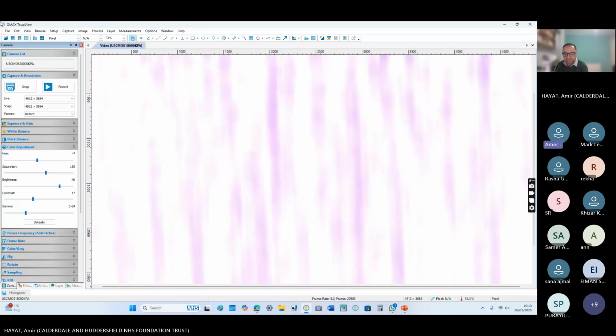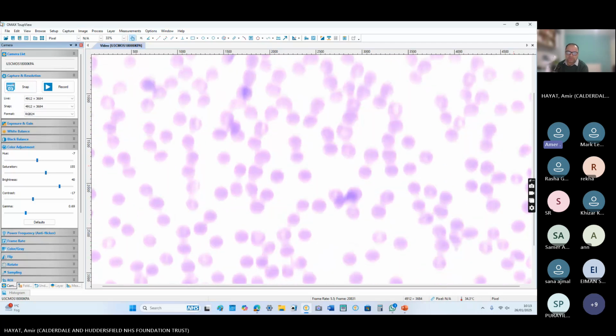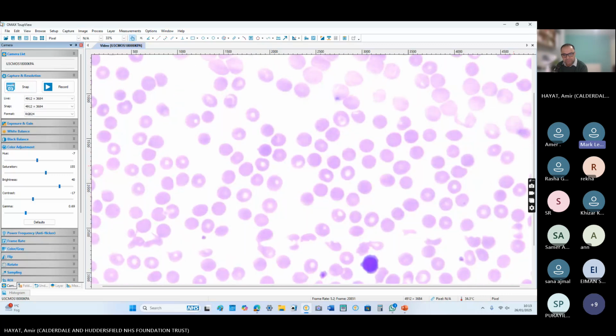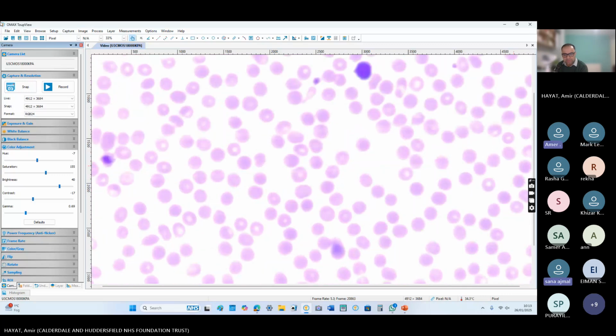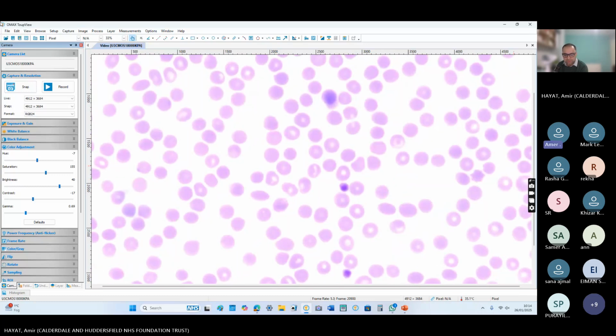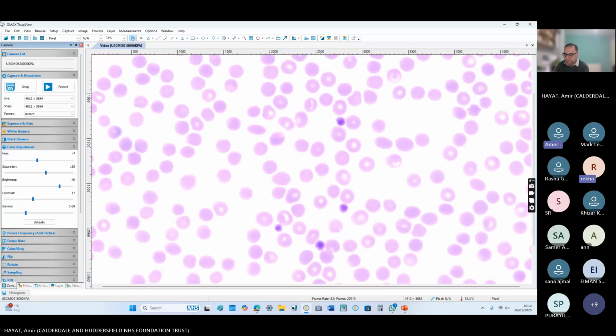So you have referred the case to the clinical hematologist because of thrombocytopenia, given the age of the child. Rekha is your clinical on-call hematologist. You have called her and she has come to the lab to review the blood film. Rekha, report the blood film.